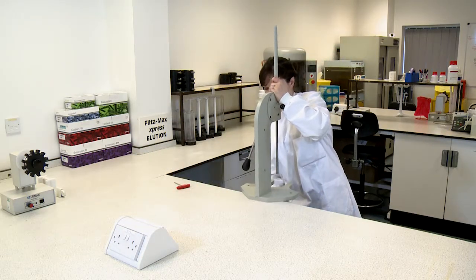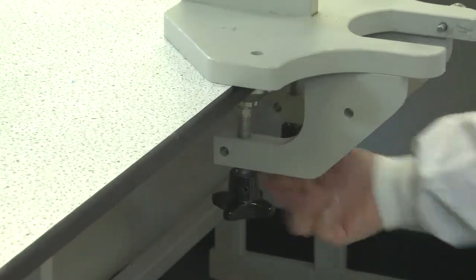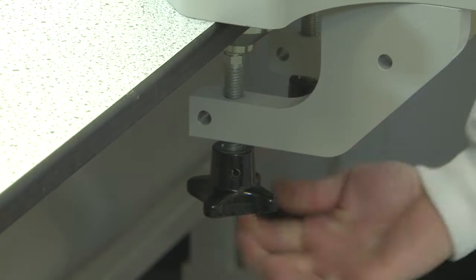Secure the wash station to the bench with the clamp set provided. Slide the clamps under the work surface as far as possible and secure the base tightly.